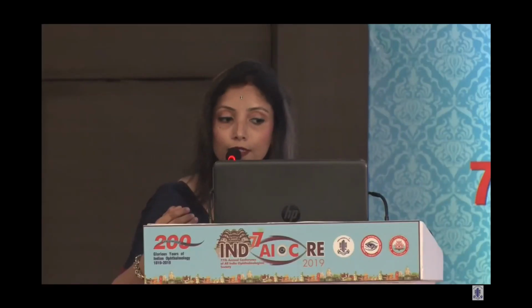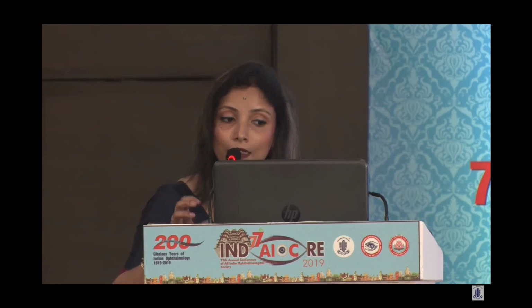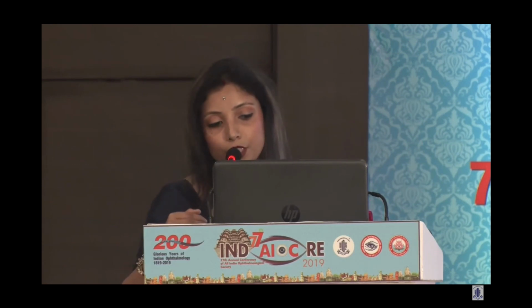Most of the linen and metallic instruments are done on a horizontal autoclave. A vertical autoclave is not preferred because it has no vacuum system. All the autoclaved instruments should be used within 48 hours and an autoclave logbook must be maintained. For heat labile instruments like tubings, vitrectomy cutters, lenses, an ethylene oxide gas sterilizer is used. It takes usually 6 hours, but since the gas is quite toxic, an aeration period of 72 hours is required.